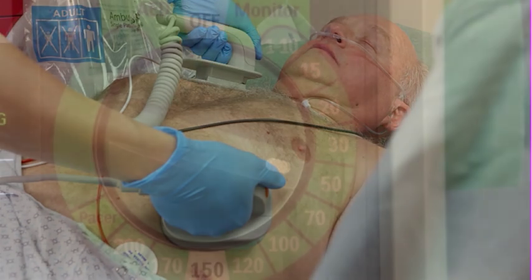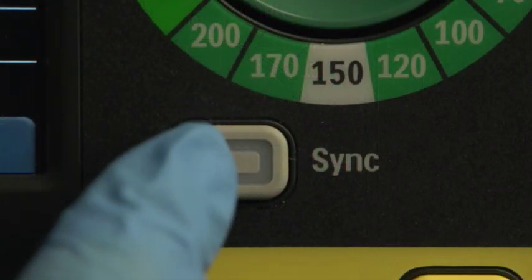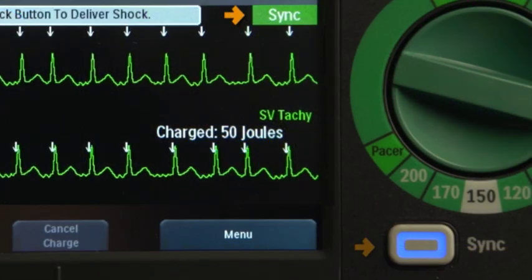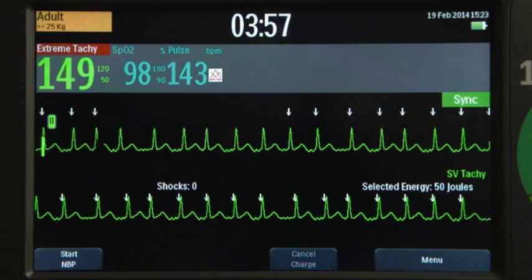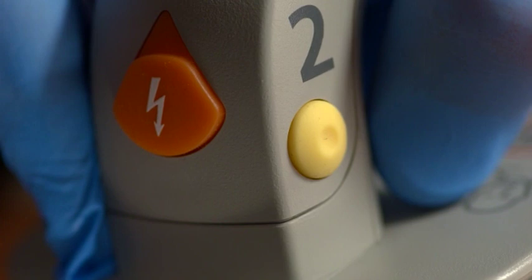Turn the therapy knob to the desired energy level setting and press the sync button. This message appears and the backlit sync button illuminates, indicating that sync mode is active. Confirm that the R wave marker arrow appears only with each R wave, signifying R wave detection, then press the charge button on the paddle.